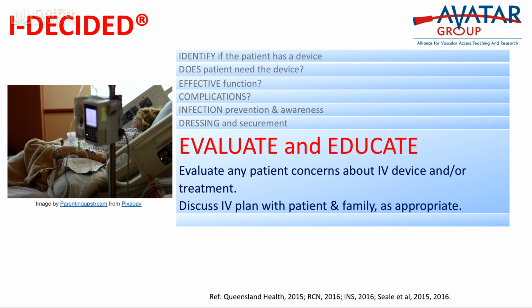For example, we tell the patient if it's painful or you're concerned about this IV in any way, please speak to one of the staff. It's important that the patient is involved because too often we leave patients out of the discussion, and patients are the ones who know what's going on with their own IV very often.